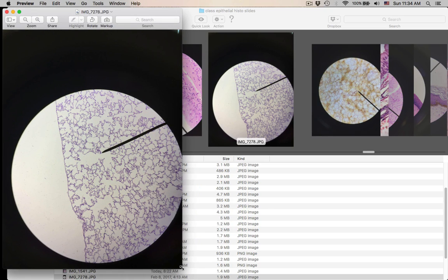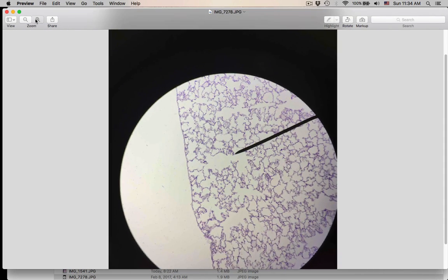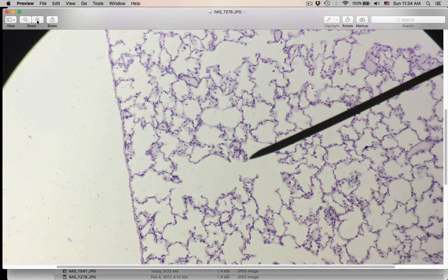26. I think you've seen this a few times too, but it doesn't hurt to reinforce. Just another view. So number 26, what organ is this from? And what kind of epithelial tissue is facing the lumen where the pointer is? Real easy to tell. I mean, you see them all over the place. It doesn't really have to be on high for you to figure it out.